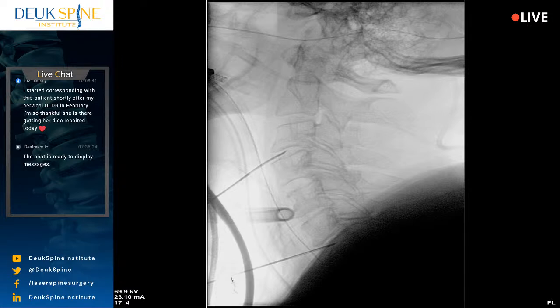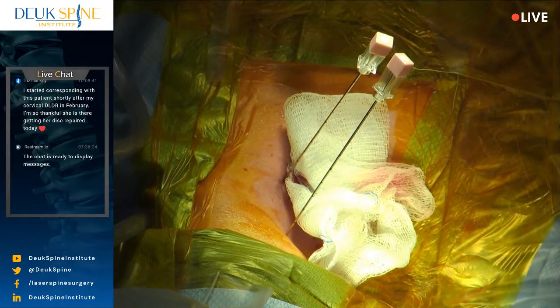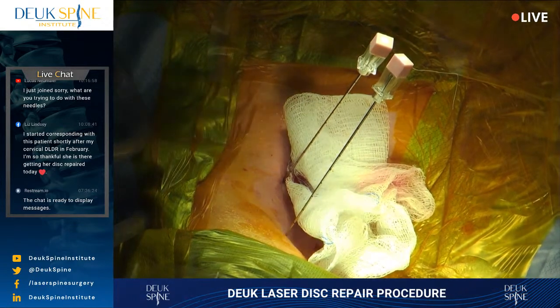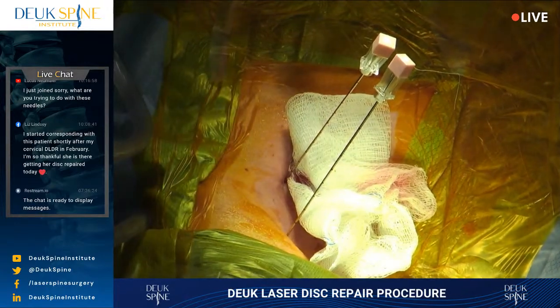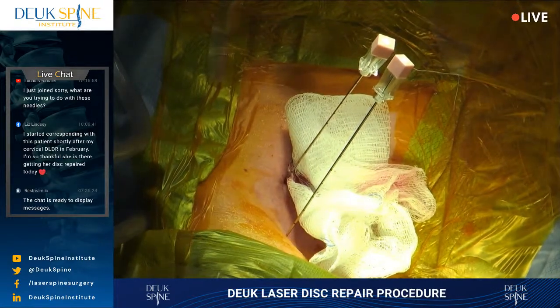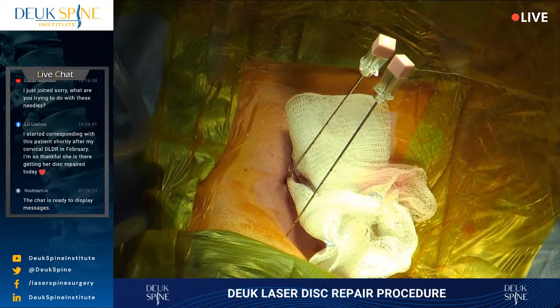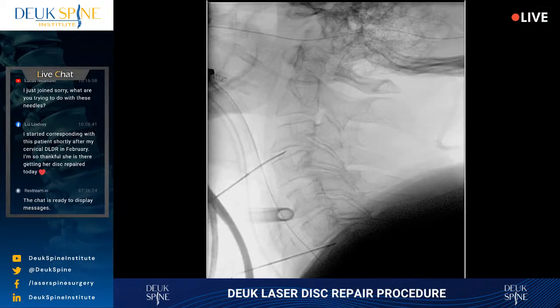All right, so let's just take a breather for a moment. And what we're doing, for those of you who don't know, is I have my anesthesiologist stabilizing the head, holding it neutral, and giving a little bit of inline traction where we pull slightly and extend. And then I have Luis pulling the shoulders down, and so we can actually see C6-7, because the C6-7 disc is very hard to see. It's really at the bottom of the cervical spine. The shoulders come into play and they block the x-rays from passing through to give us a good visualization. But I'm happy with that view. All right, so next, like I said, we're going to do our discograms. We'll start with C3-4, which is the top disc we'll be fixing today.